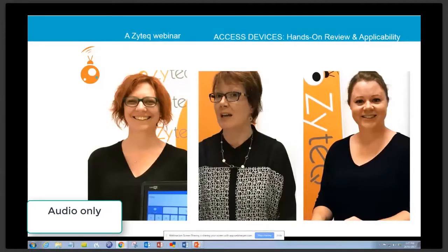We know it's important to start with the person and matching the technology to the person, to use Marsha Shearer's framework. And as this next step, we know that you want to understand all the devices that are available on the market. So that's the purpose of our mini-series of webinars.